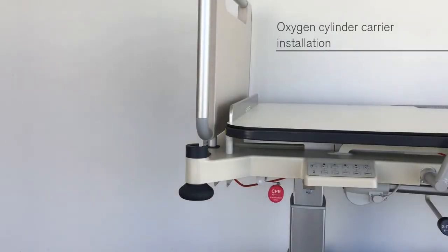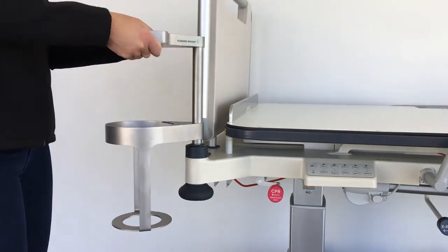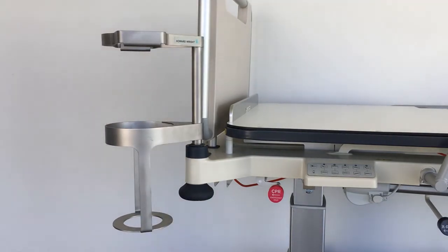A range of oxygen cylinder carriers are available. Plug the oxygen cylinder carrier into one of the bed's four corner accessory sockets.